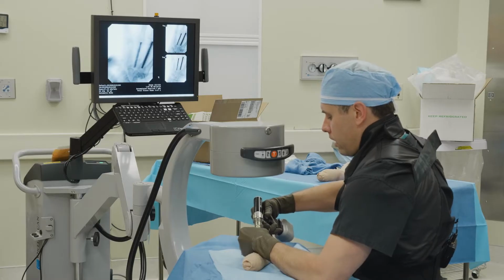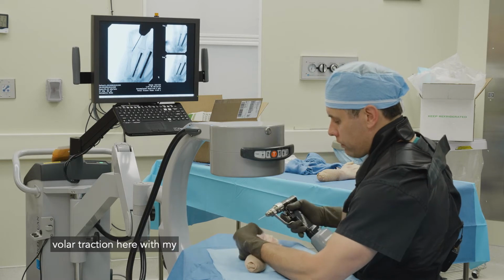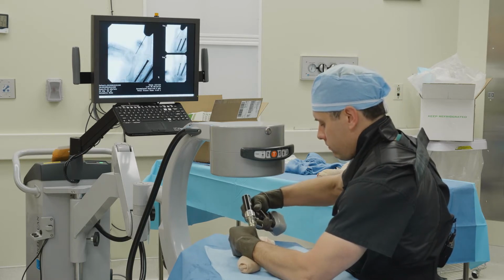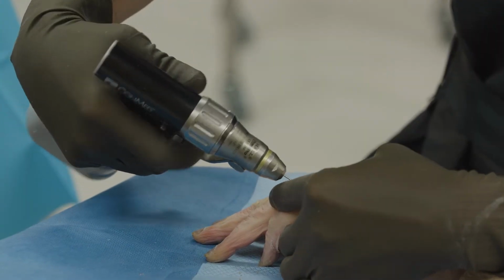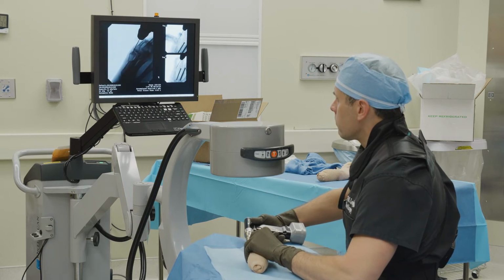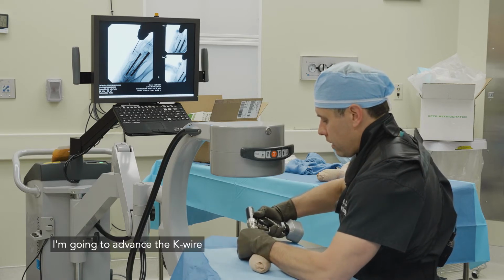So we'll start at the center of the head as always. Try to get the dorsal third, and I'm applying volar traction here with my other side of my hand. So I'm happy with the dorsal third placement there. I'm happy with the center of the head. And now as I hold manual reduction, I'm going to advance the K-wire down the shaft.